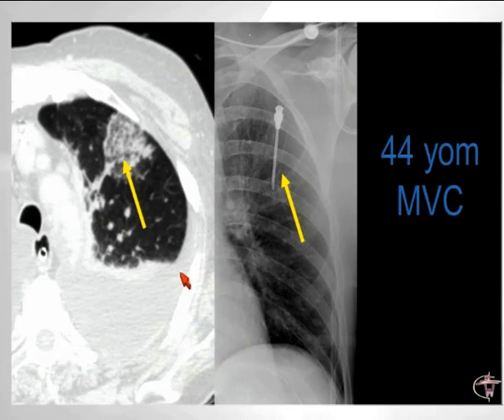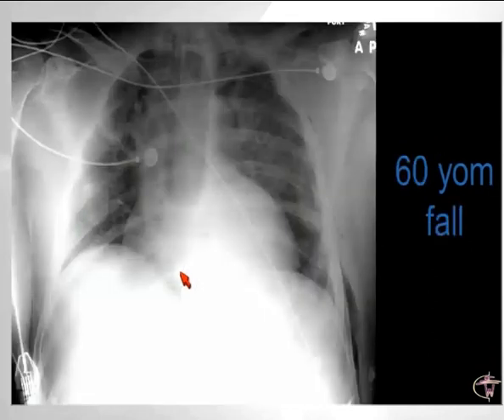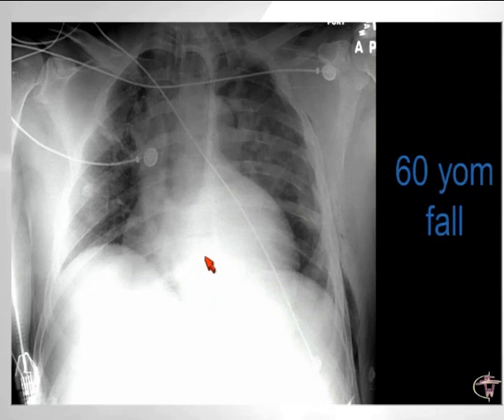And that's why the paramedics in the area where I work have devised a different approach. Instead of using these rigid large bore metal cannulas, they use large bore IV lines, which are inserted in the second intercostal space, but then the stylet and the needle are retracted and only the plastic tube is left behind. And this is what they look like.